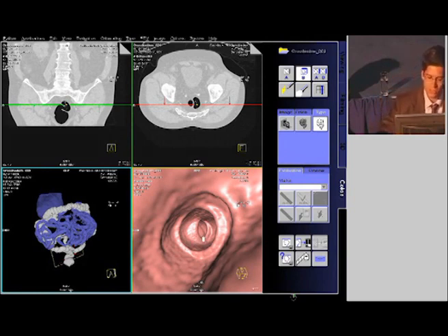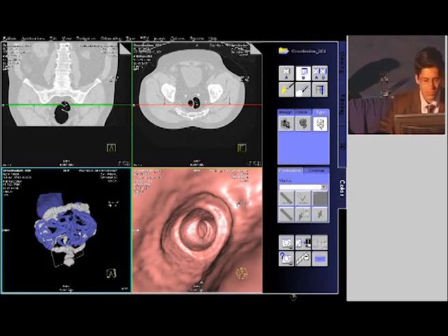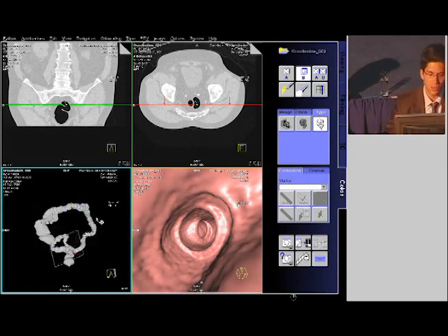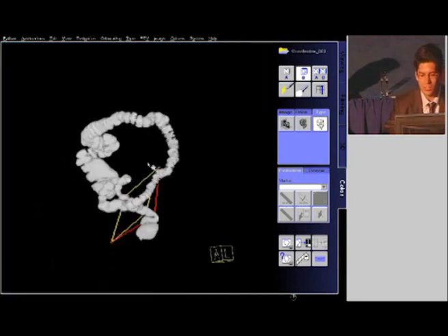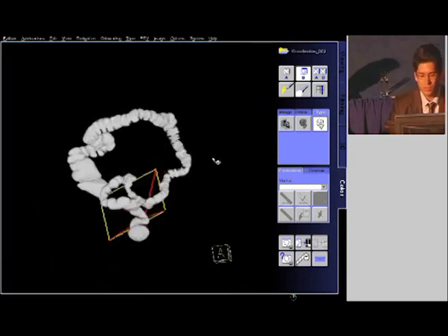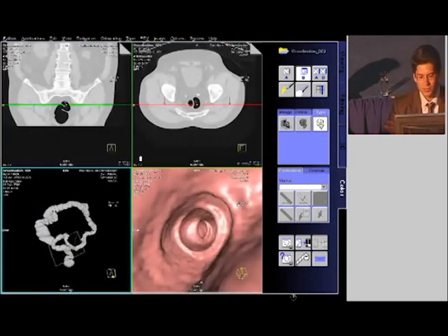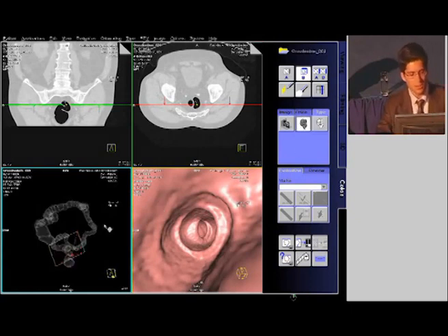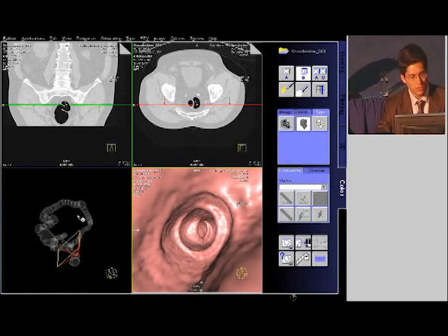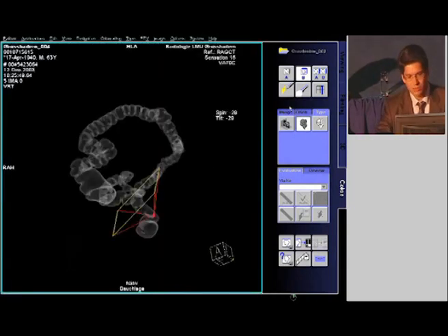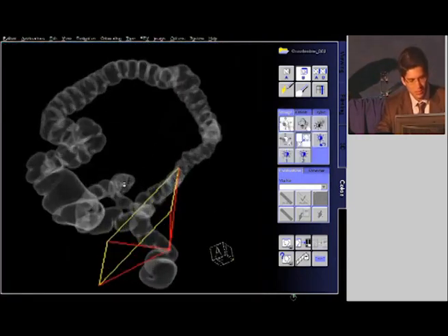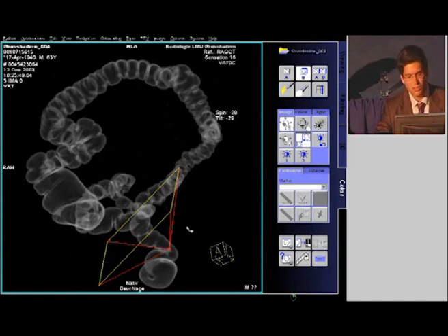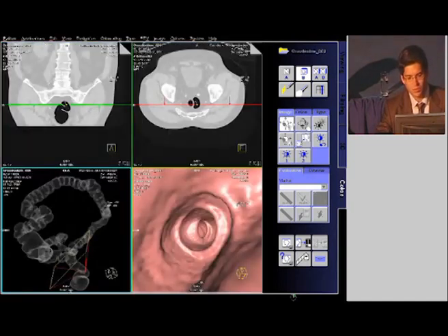We're setting here and you say this is mobile, I don't need this anymore, just hit the delete button and this is going to be subtracted, leaving you with this nice volume-rendered image of the colon itself. This is actually the plane of my camera here. To see that better, I'm going to switch back to the DCBE view. You can see now clearly that we are sitting with the camera right in the sigmoid, and this is where we're going to start our evaluation of the fly-through.